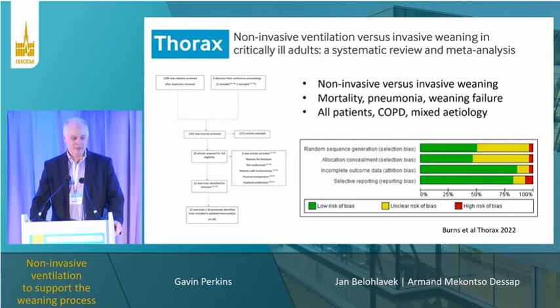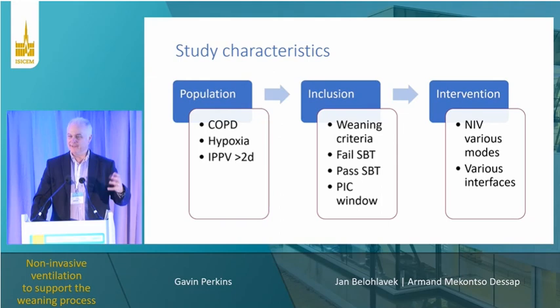If you want to take a bird's eye view of the evidence informing the use of non-invasive ventilation to facilitate weaning, then this Cochrane review published in Thorax provides that view by pooling all of the evidence from 28 different studies together into a single place and asking, if you take the technology of non-invasive ventilation, how effective is it for improving outcomes? And I think when we come to the next few slides, it will be impressive, really, the amount of research that has been taking place of randomized controlled trials in this setting.